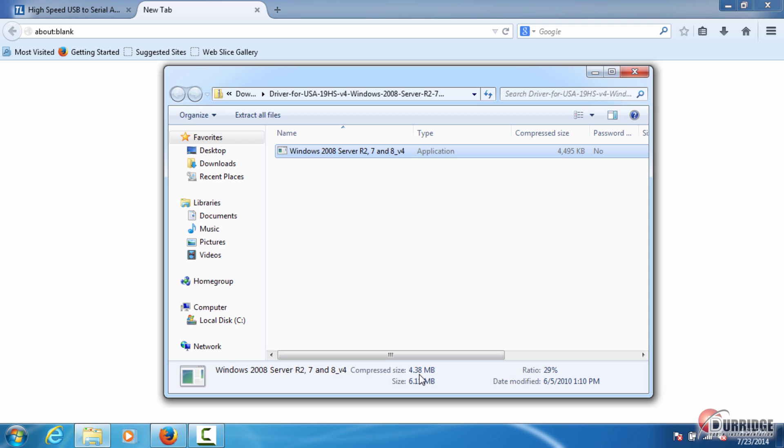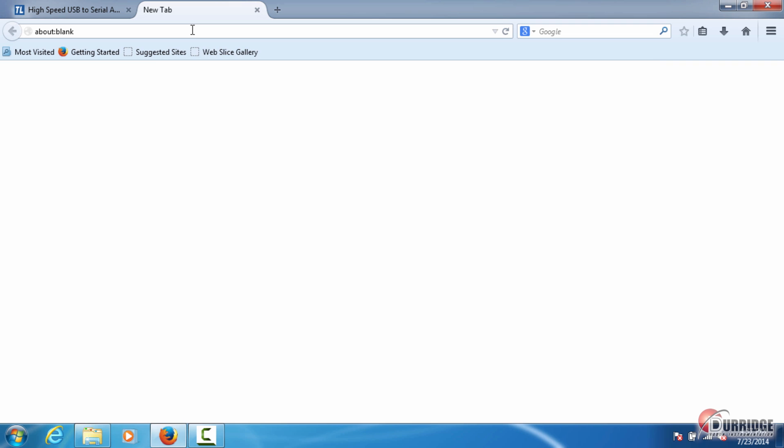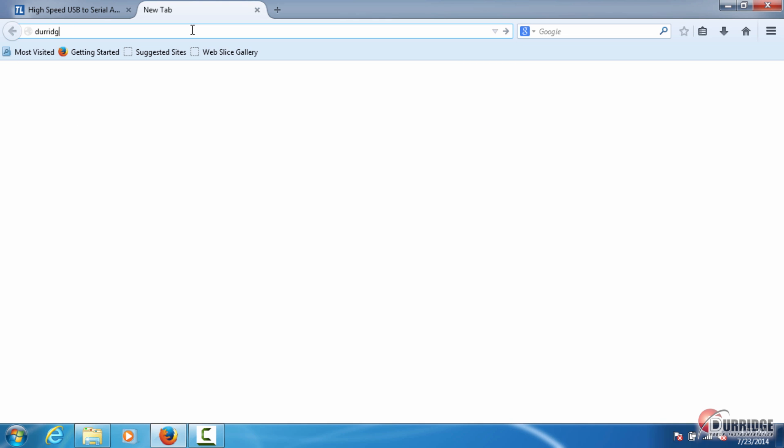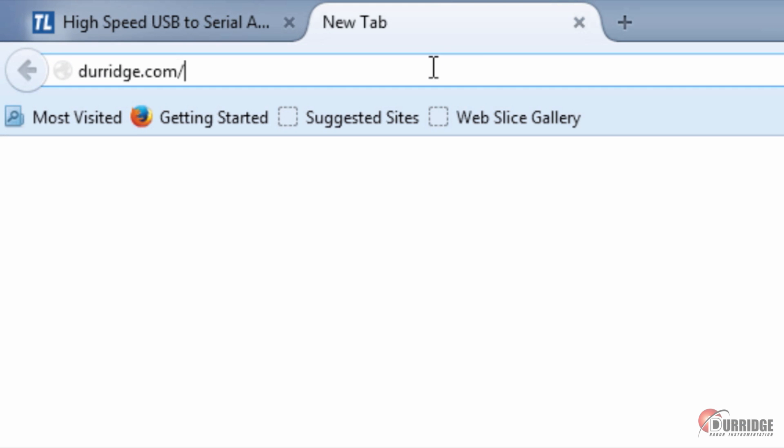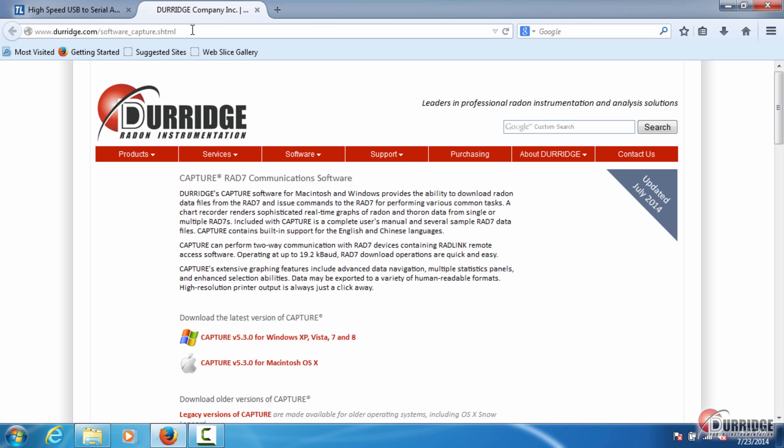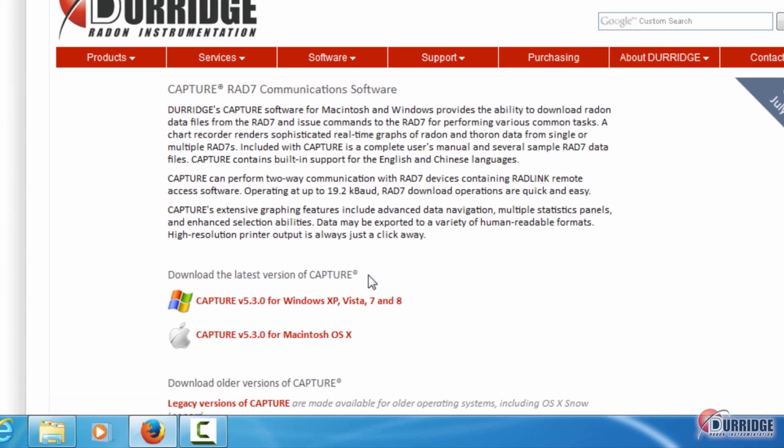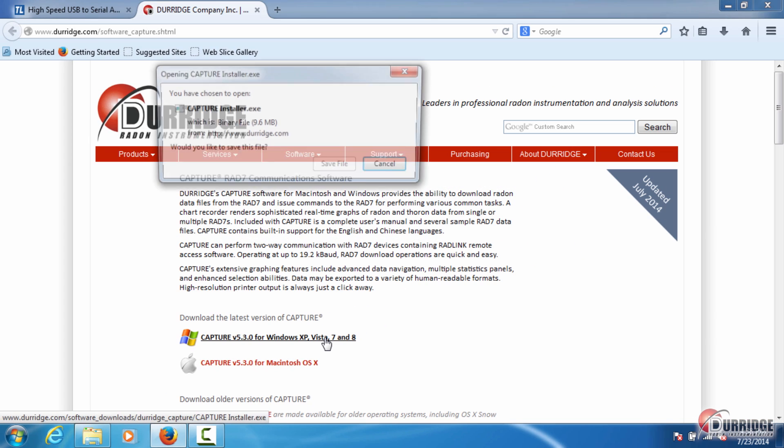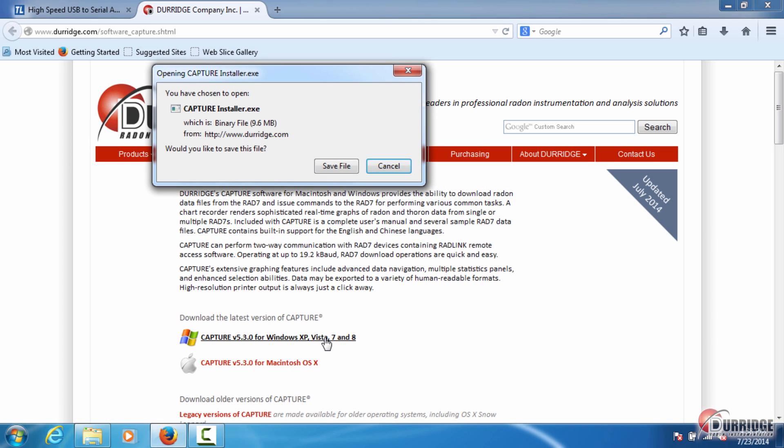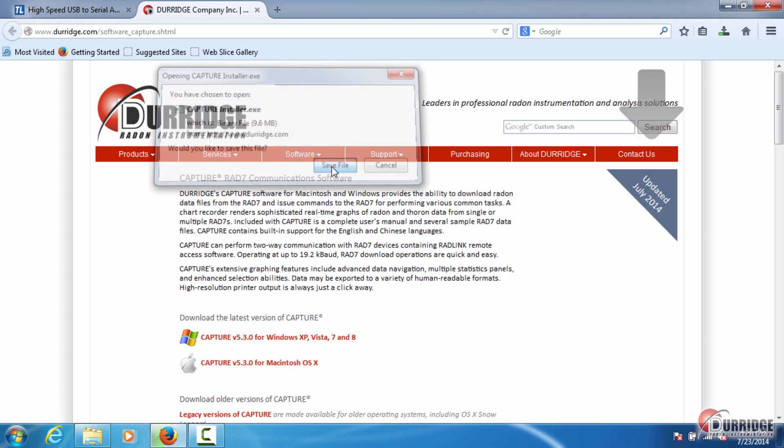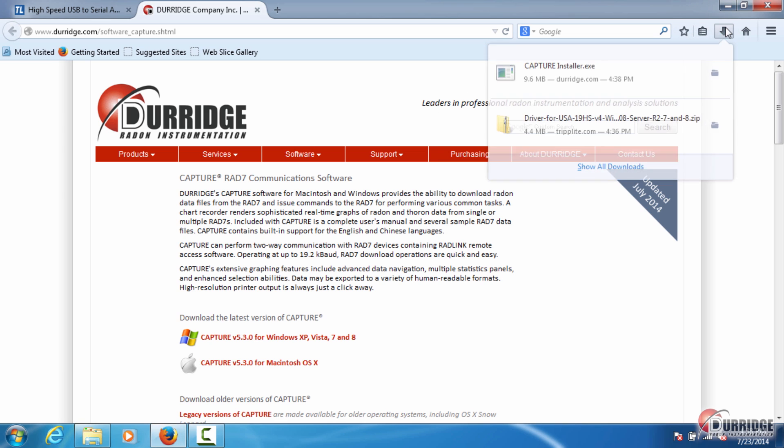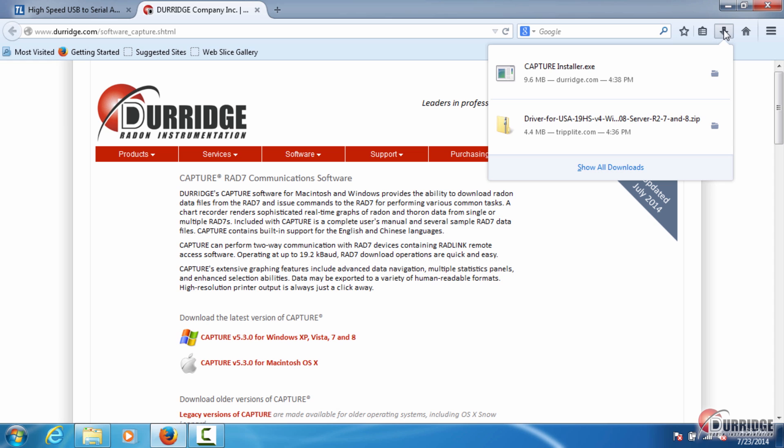The second part of the install process is putting the Capture application on your computer. You can install Capture from the Durridge USB drive, or visit www.durridge.com/capture. Find and click the download link for the latest version of Capture for your operating system. In the browser pop-up window, click the Save File button. When downloading is complete, find the file called CaptureInstaller.exe, and click to open it.